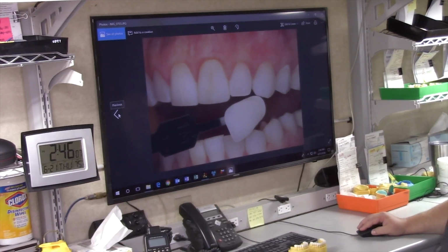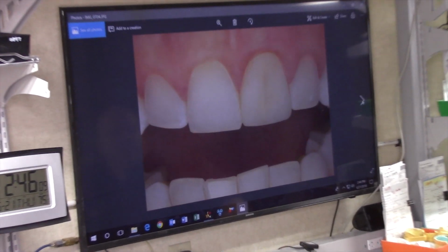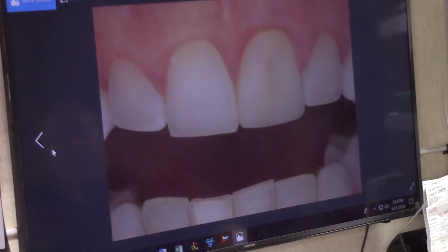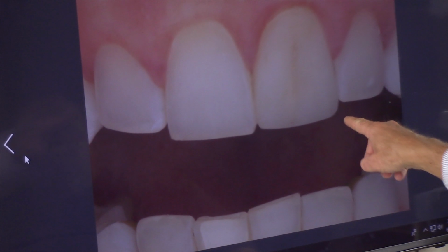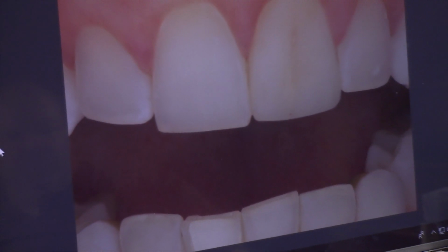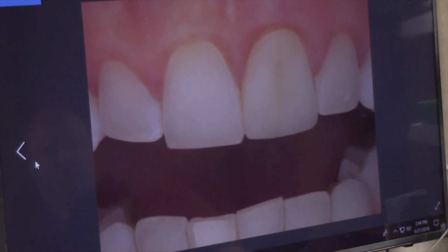So why don't we just leaf through those a little bit, Phil, and you can see those. So you can see, let's go back to that one. I don't know if you'll be able to see on this video, a lot of amber in that incisal edge that didn't show up with the previous non-polarized picture.